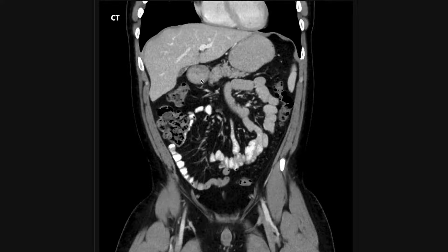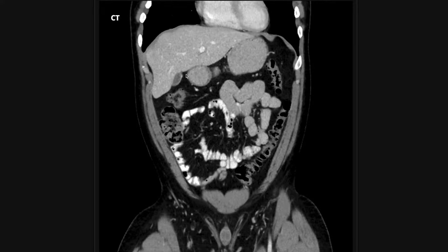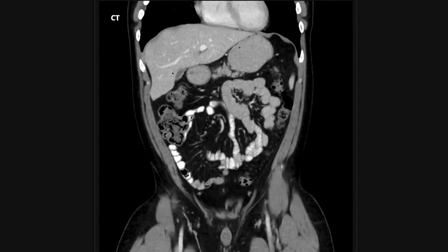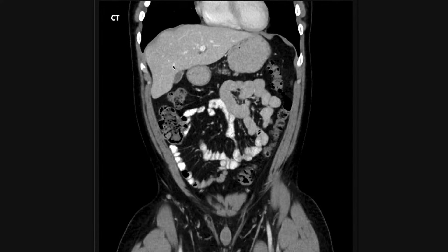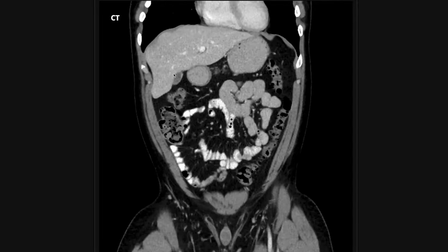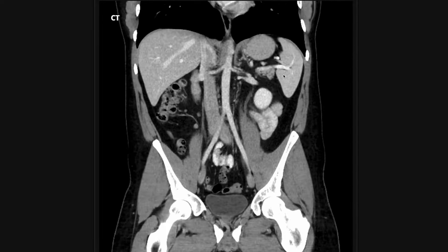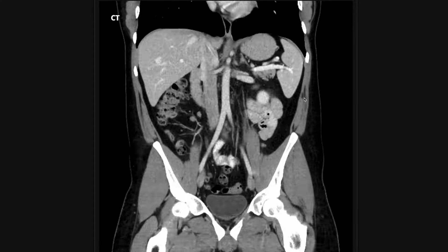I take a look at the gallbladder — this is a normal looking gallbladder and I don't see any obvious stones. A lot of stones will show up on CT, though some won't and you'll see them on ultrasound instead. I then look for the adrenal glands, which can be hard to see especially for beginners. The adrenal gland looks a little bit like the Mercedes-Benz logo.